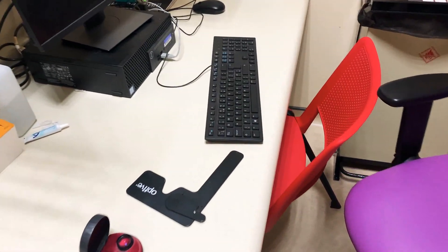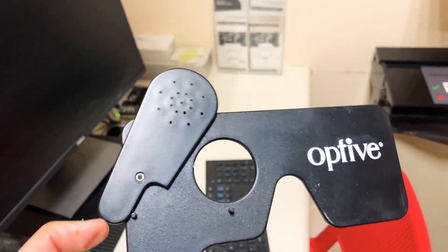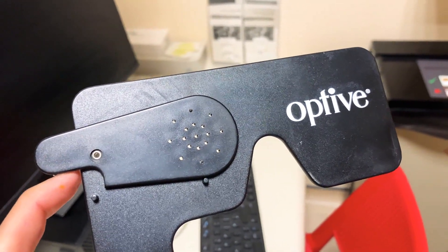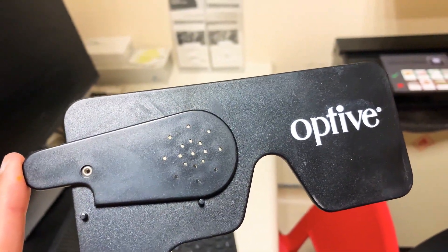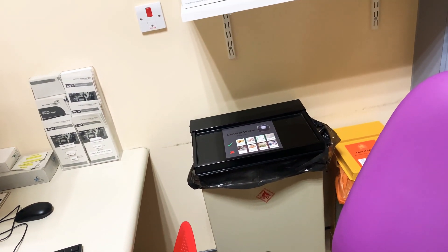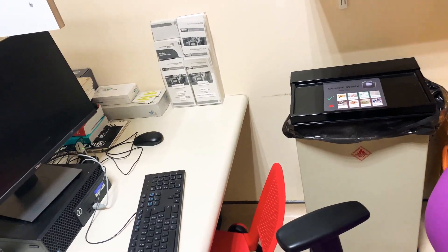You can refine the result further by asking the patient to look through the pinhole. Some people see a bit clearer through it, as it reduces aberrations. The most important thing is to ensure the patient is wearing their glasses during the test — their corrected visual acuity is what really matters.